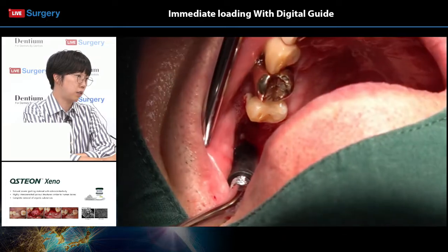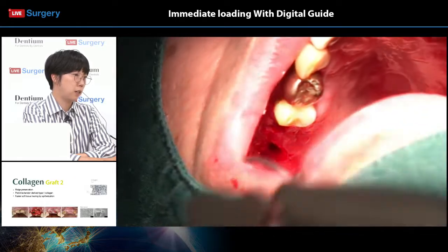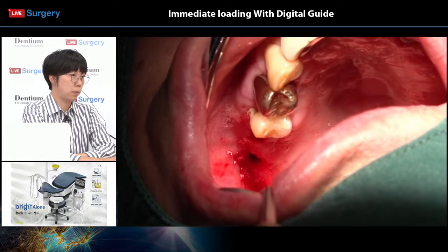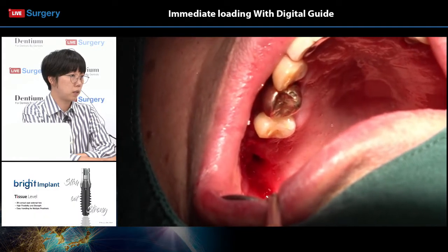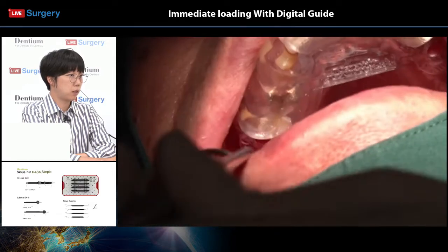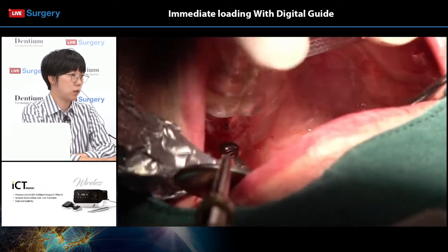Okay, so Dr. Lee has put bone graft material into the number 17 area and is performing the sinus floor elevation as well as bone compaction using the osteotome. I think he will try to place the implant on number 17 once more.